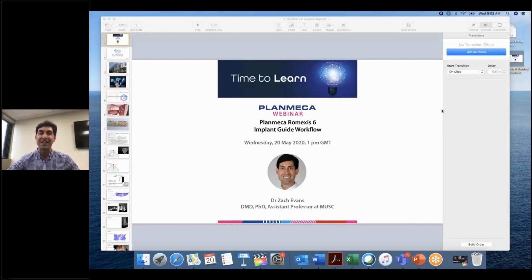It's morning here, but I know a lot of you are a little further along in the day, scattered all around the world. So again, it's my pleasure to be sharing some of our experience using Romexis 6 for Implant Guide workflow. We've been using it for a while. We were really fortunate here at MUSC, and I'll mention it again: we have a really nice partnership with Planmeca, and we do a lot of beta testing and some consultation for product development with them.